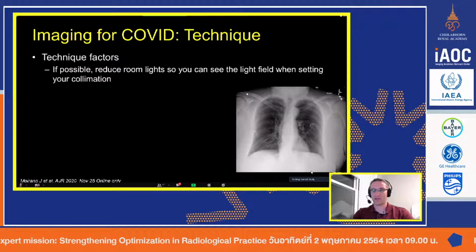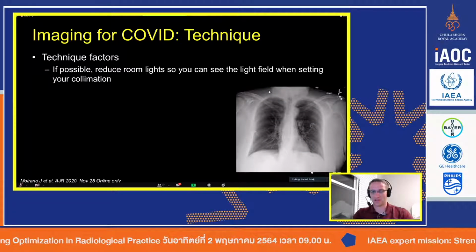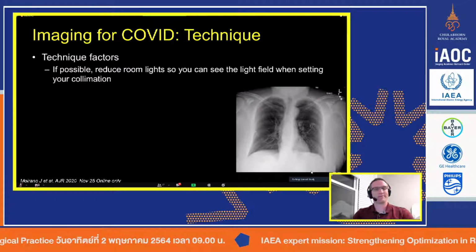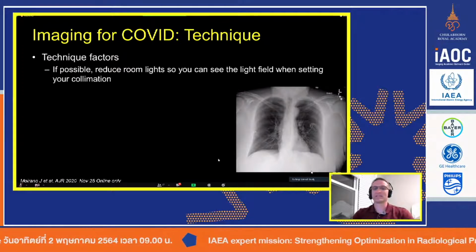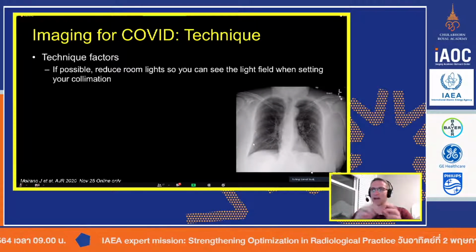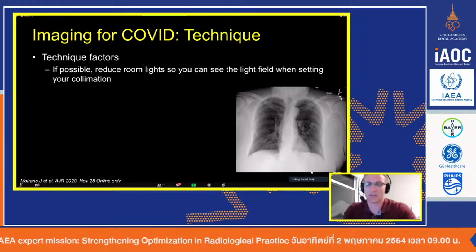And that is why a lot of the COVID images have your lungs, and that's good, but they might include a lot more of the human anatomy. It is what it is. So the image quality will come across. It won't be nicely mapped. The blacks, the whites, the grayscales won't be as nicely mapped, but it is what it is.